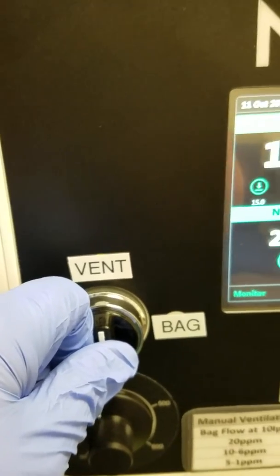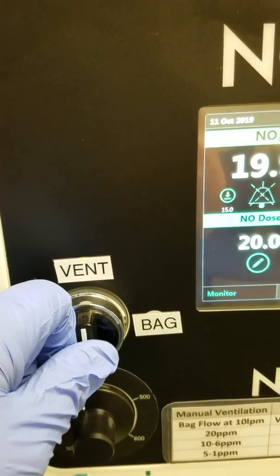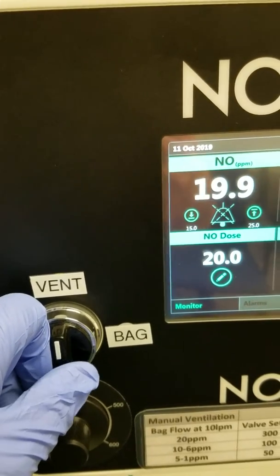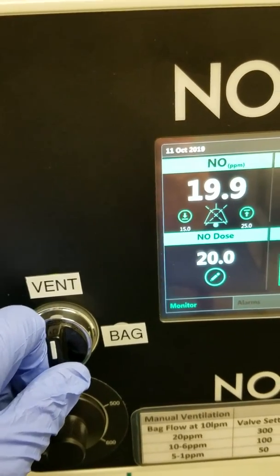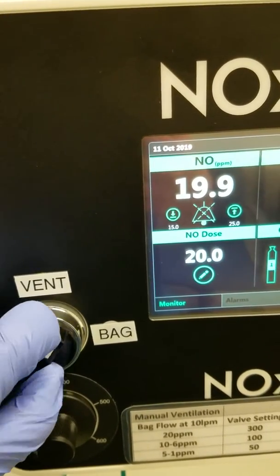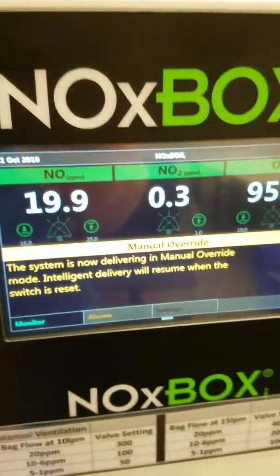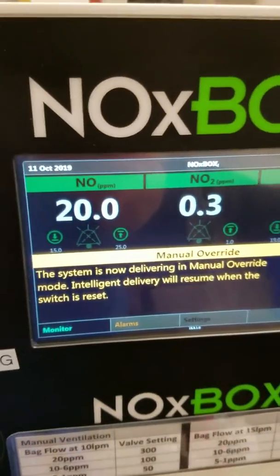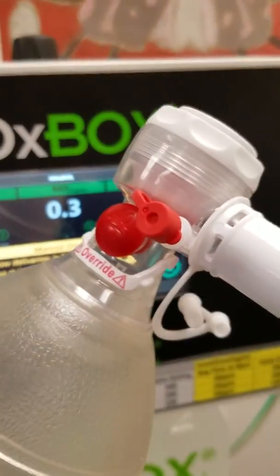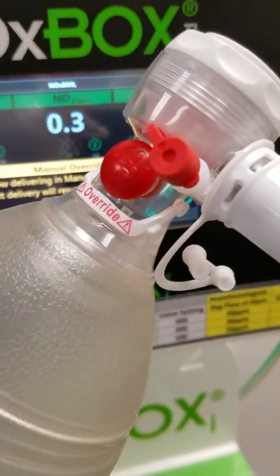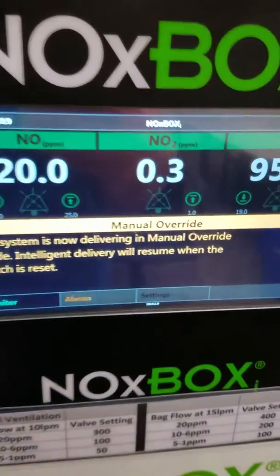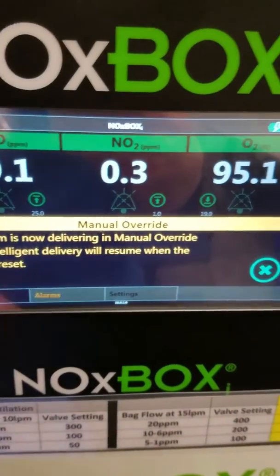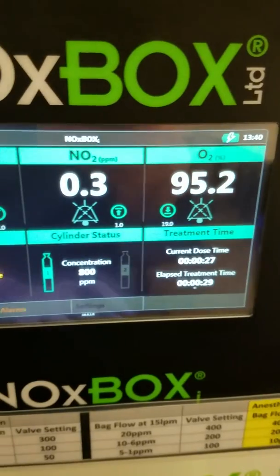I'm going to switch to the 3 o'clock position, which will divert the nitric flow to my manual resuscitator or bag. I'll turn the switch. I'm going to get an alarm that says manual override. My flow is now being diverted to my bag. You can close this out.